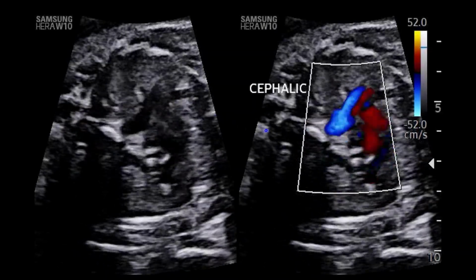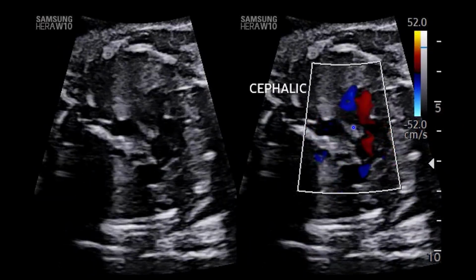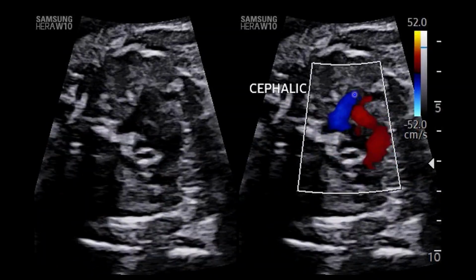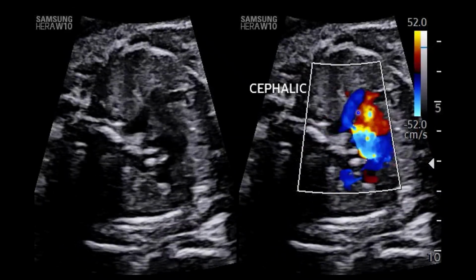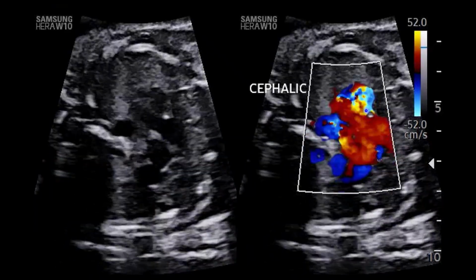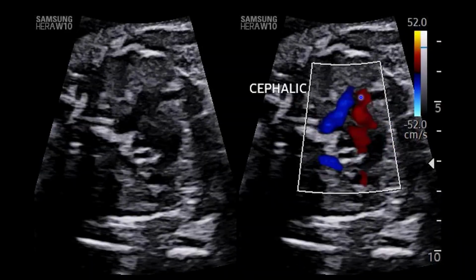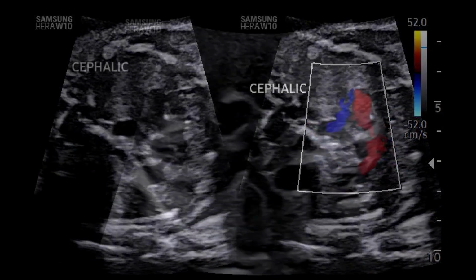And so this is what we would call a normal variant, where we have antegrade flow through the aortic arch, antegrade flow through the ductal arch, but it takes this slightly tortuous course here and comes back into the descending aorta there. Now, one must evaluate this flow velocity through the duct in these tortuous curves just to make sure that there's not accelerated or obstructed flow through these curves in the ductal arch.